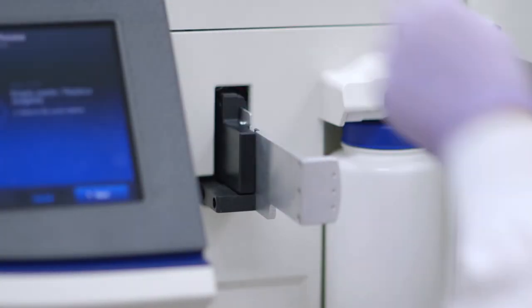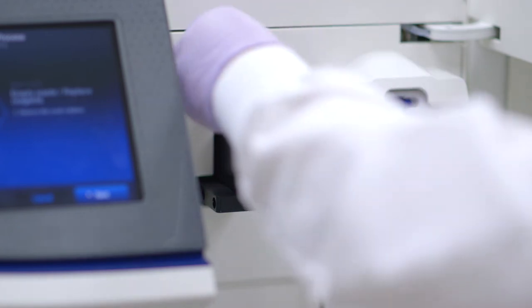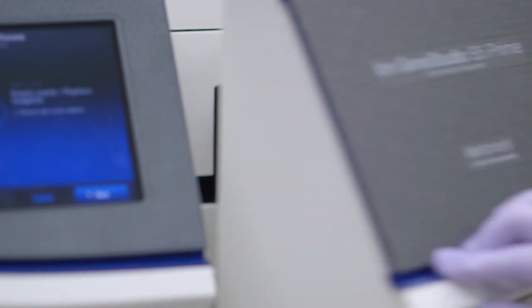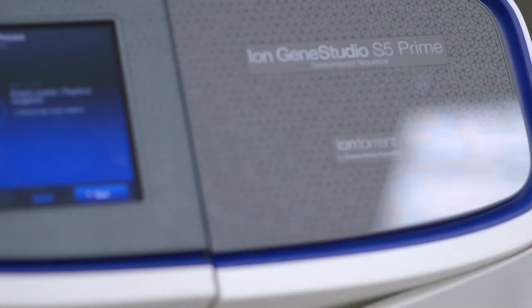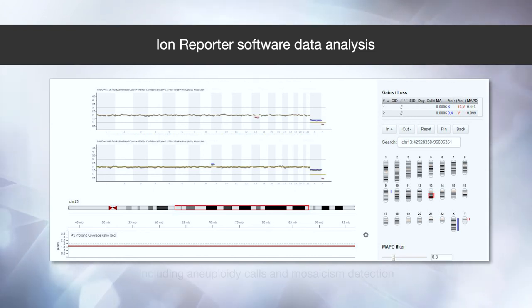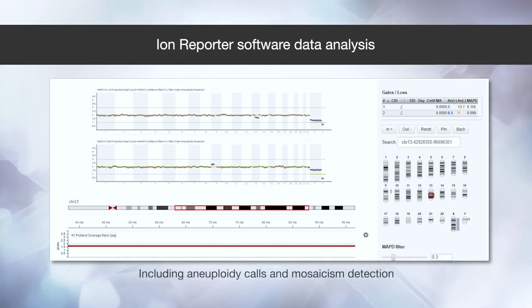Once initialization is complete, you take the previous chip out of the sequencer, load the new chip with your PGS samples hot off the ION-Chef, shut the door, and now we are ready to start sequencing. And once the run is completed, data analysis can be automatically started with ION-Reporter software for results interpretation, including aneuploidy calls and mosaicism detection.